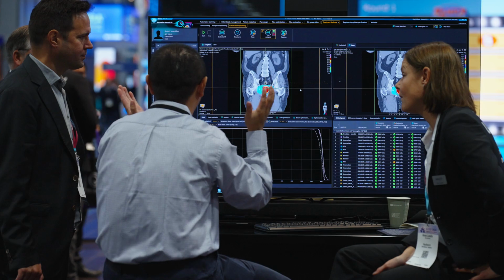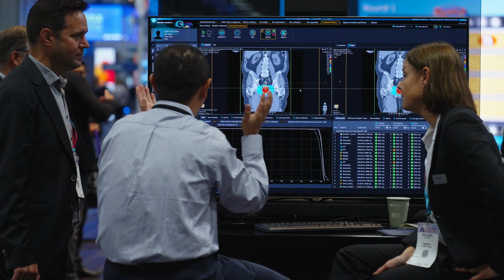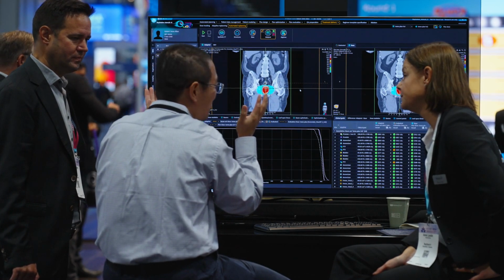But maybe a less obvious one is consistency. When you apply AI models, they generate consistent results. You don't have large variations in quality, but also in the naming of things, such as what structures are named and treatment plan labeling. In the longer run, with more consistent data, you can analyze the data more easily. I think that's one of the big things in addition to efficiency.